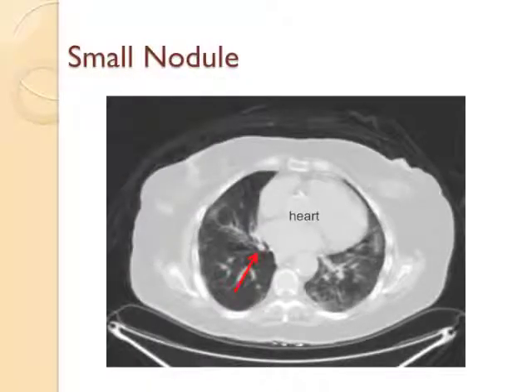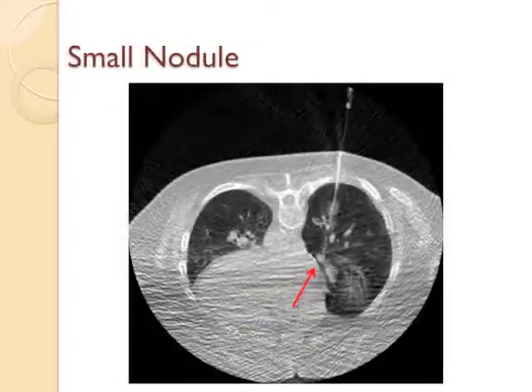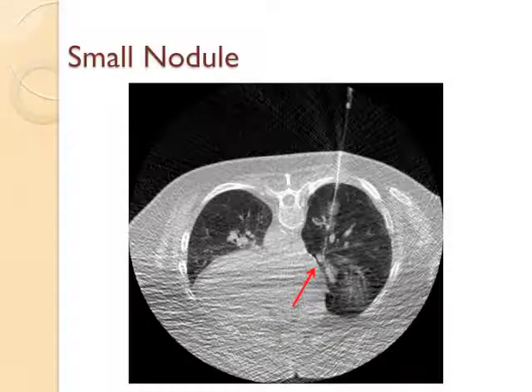Here's another nodule right here, very small. This is the patient's heart. And this nodule is located very near the heart. And they did a PET scan. This is an actual PET scan. And it's very hard. This very faint area was where the nodule is, and it's a little brighter than it should be, which suggested it was malignant, but nobody was sure. So they wanted to try and get a small amount of material before they operated. And here you can see I went the long way. I laid the patient face down. Here's his heart. Here's his spine.